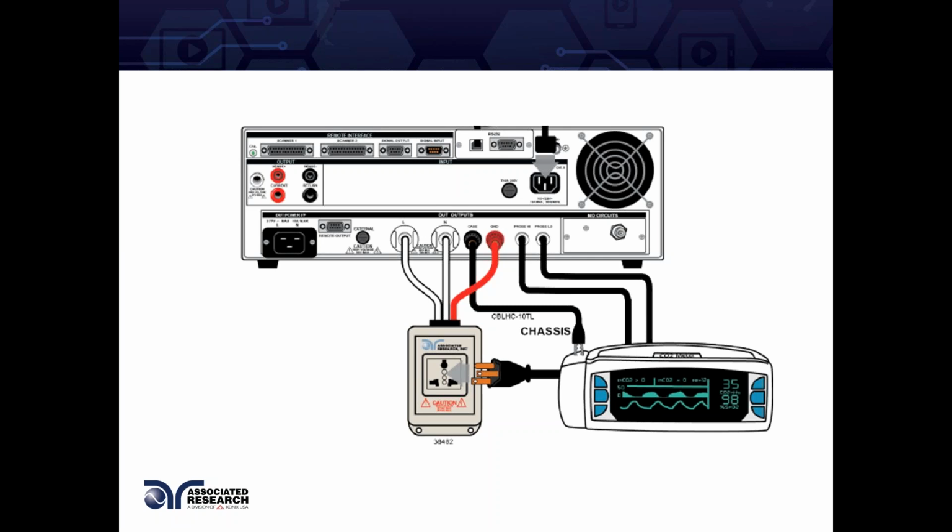This is the reason why you're not able to run leakage current tests using a normal wall outlet. You're not going to be able to generate 264 volts from a normal wall outlet. So you need to have a mechanism of either an additional AC source built in, internal or external, to power up this device under test. So let's take a look at the device under test here.